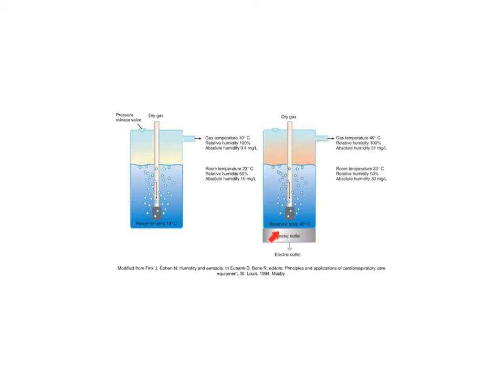So the heater can either go underneath or sometimes they're on top, and that's called either a collar or a yoke heater. Now, most are designed for low flow systems and not heated. There are special bubblers, and depending on what hospital you're at, their policies and protocols are going to be different. For example, at St. Anthony's, once a patient got above 6 liters per minute while they were on the floors, that's when we'd start to call doctors.